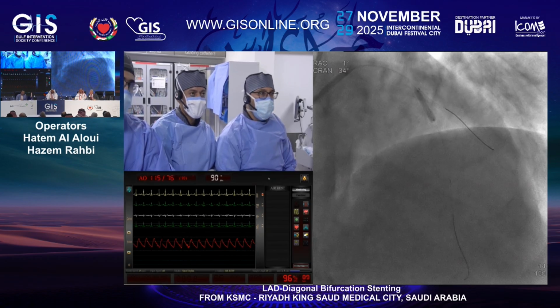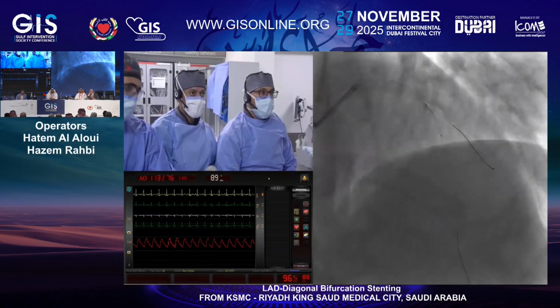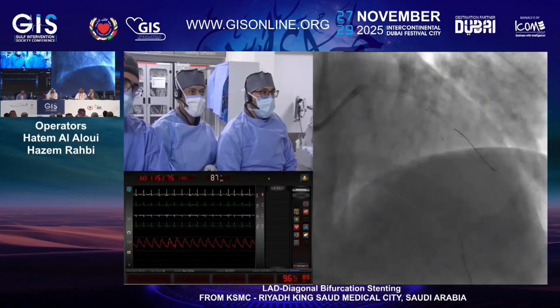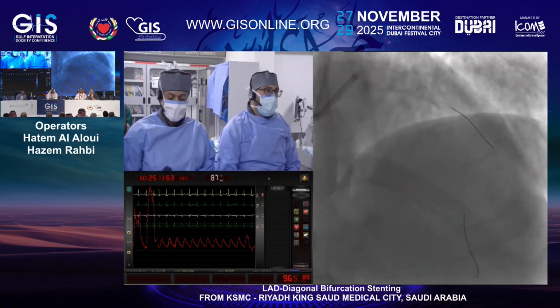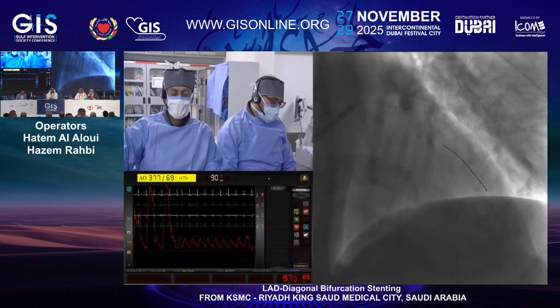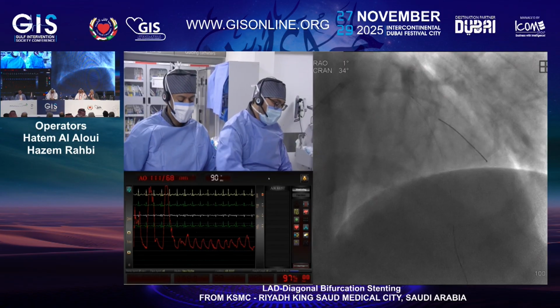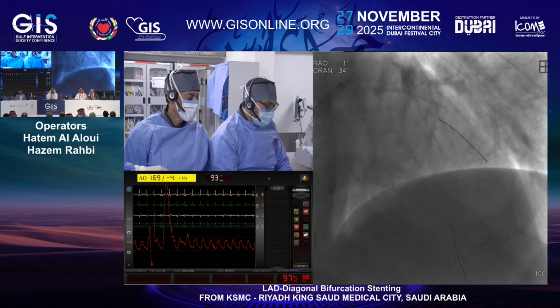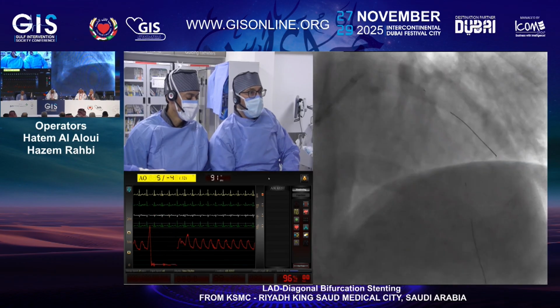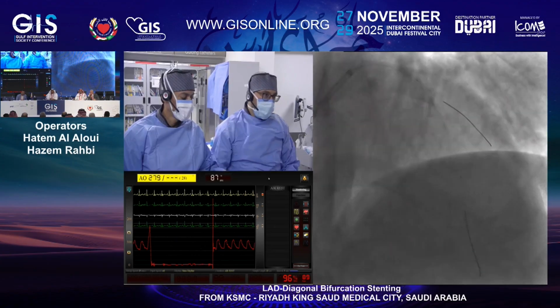Would you prepare the proximal segment also, because it has a significant fibrotic disease and some calcium, before stenting, or you just go directly? No, I will try to land at that aneurysmal part, as you have seen. Proximally to the diagonal, there is no really severe narrowing. It's more about positive remodeling.